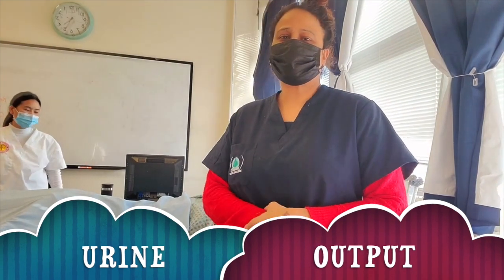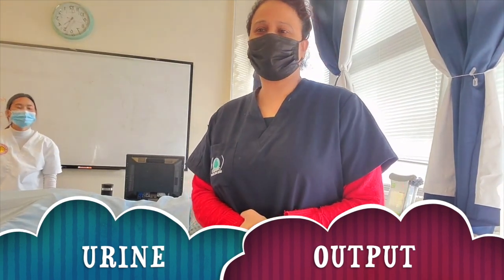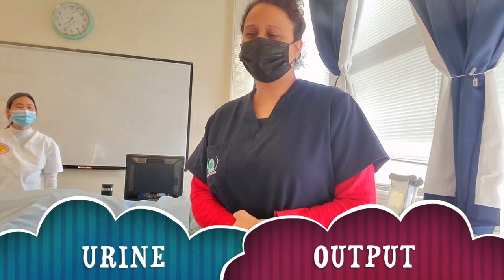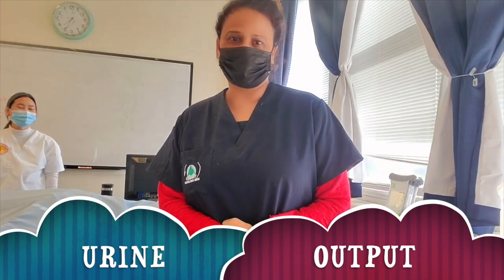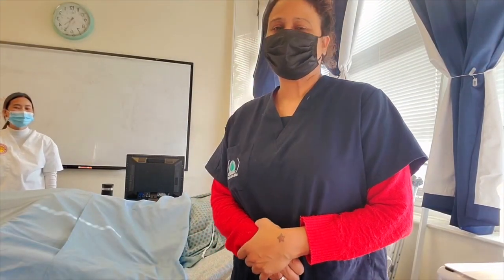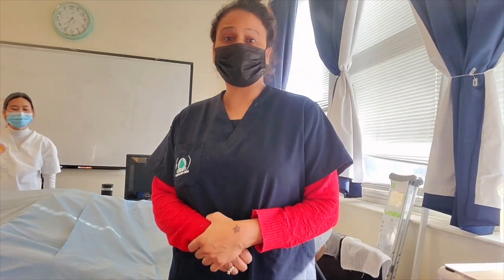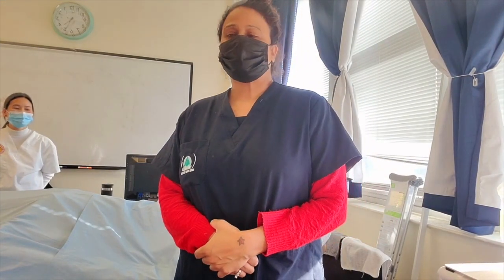Good afternoon students, I'm Miss Henderson. Today I'm going to demonstrate how to measure a patient's input and output. This is one of the Prometric skills required to pass your state board license.